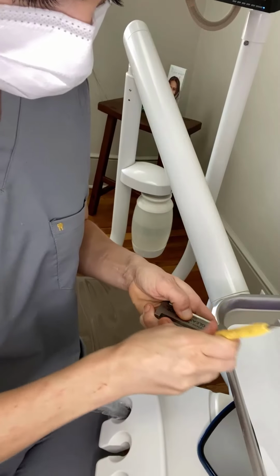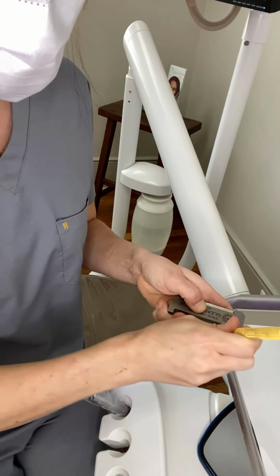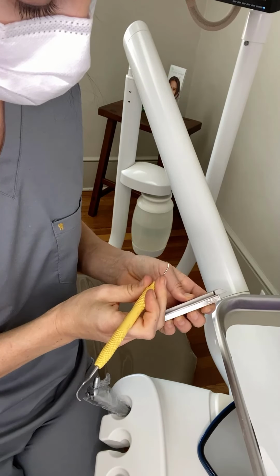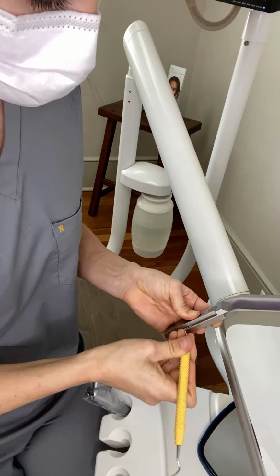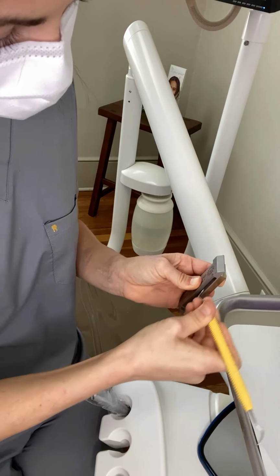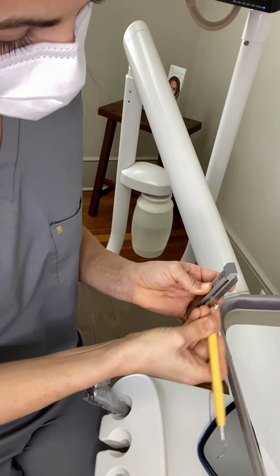I'm on my lunch break, and last week I got a bunch of questions about the Gleason guide and sharpening with it. I've had an IGTV video of this, so you can go back and look at that one. This one's going to be a little bit longer because it's maybe a little harder to explain, but once you get the hang of it, it's so easy. And I try to remember that it wasn't always so easy. I've been doing this for a solid 15 years. I've had this little Gleason guide that long. So let's take a look.